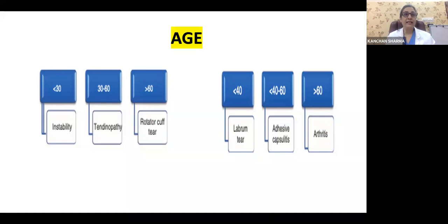When I say complete tear, it means I have broken the wall completely. So when you try to stretch that muscle, you will see that both the ends move apart, and we can see all this with ultrasound. So tendinopathy is a broad term. You can have a tenosynovitis, a tendinosis, a partial tear, or a complete tear. So when I say tendinopathy, it means all four of them.